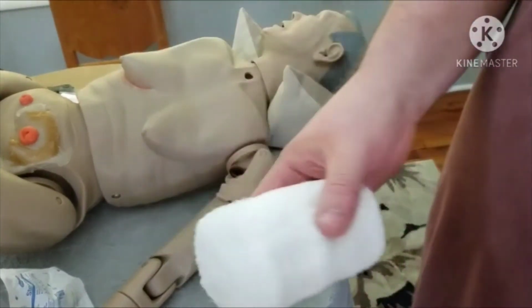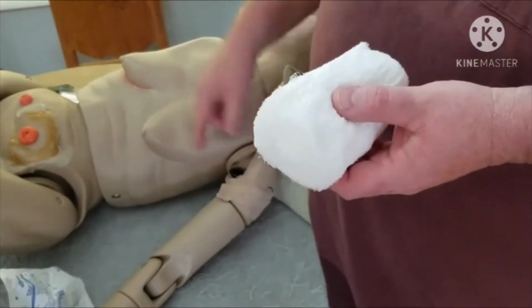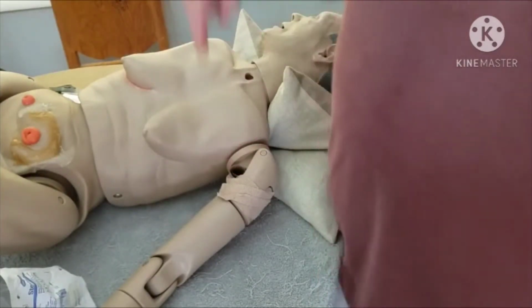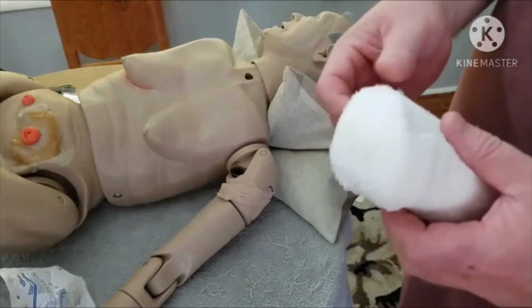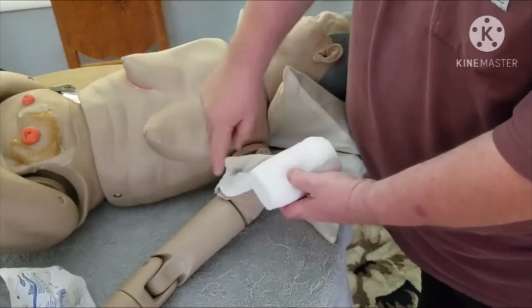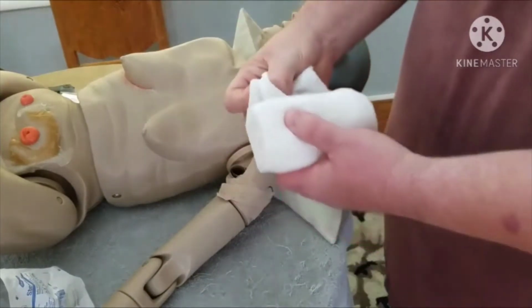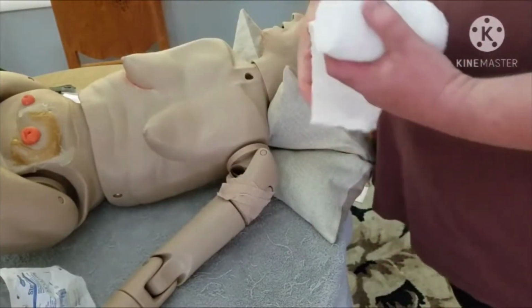Now, the Kerlix, the idea is to pack that wound, to get pressure down in there and keep pressure down in there. You don't want to put your finger down in there and then pull it out. And understand, you're going to have to get your finger in there. You can't pack it from the outside like this and just sit there and push on it from the outside and try to pack in there. That won't work. It won't get pressure down there. What it'll do is go in there about an inch or two wide up, and then you're just going to be packing the top and leave that whole area underneath there open.